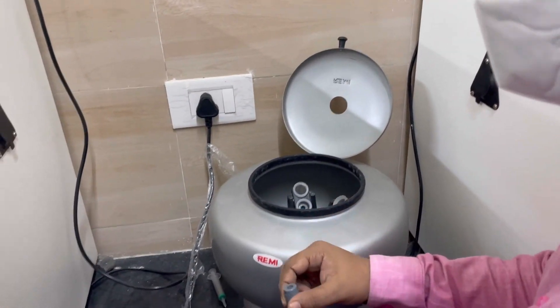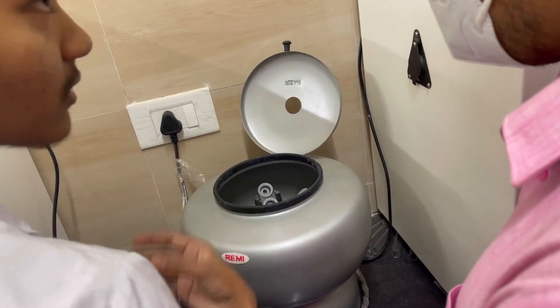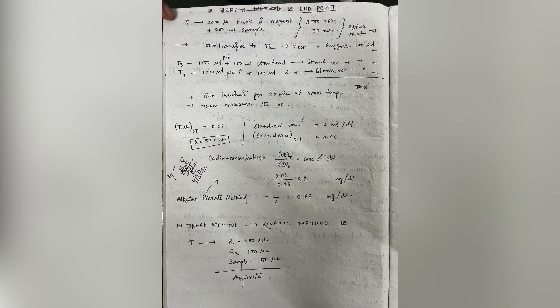The solution is then incubated for 20 minutes at room temperature. Finally, some part of the solution from above is taken and its optical density is measured using a spectrometric device. Two other setups are also made — one of standard and another of blank.